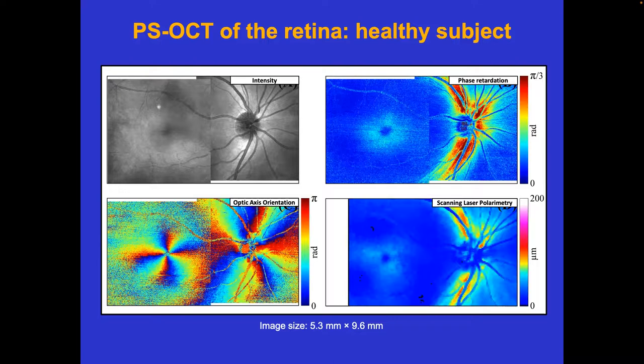So you want to measure as soon as possible if that decay is still progressing at a rate that you don't like. So really, measuring the nerve fiber layer thickness is an issue. You want to do it as accurately as possible. And this is basically a new method. We've done this a long time ago, but if you want to do proper glaucoma research, you need to enroll like 400 patients. So it's a really big study. I'm not ready for that.